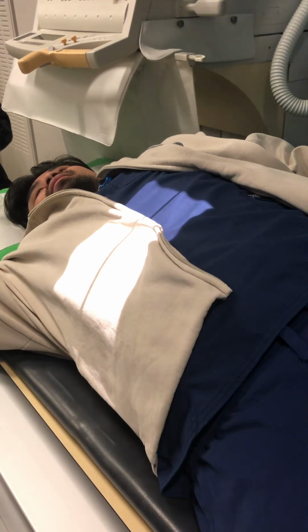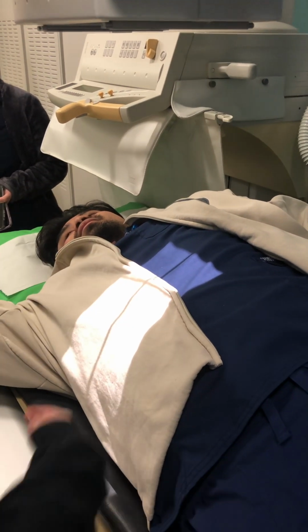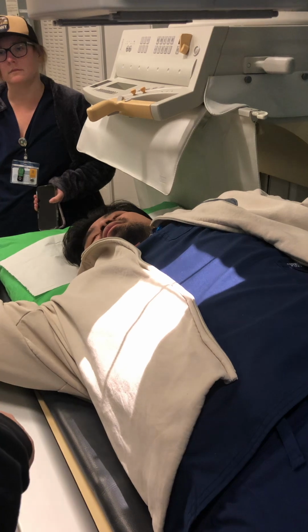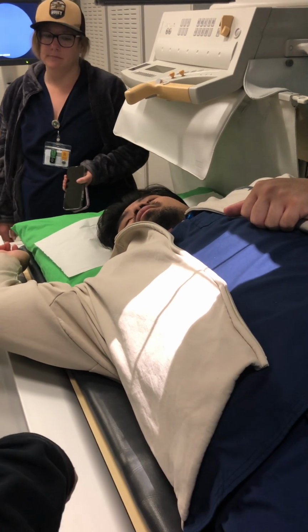So how do you find the centering horizontally on this one? So again, if you're going to think about going from here to here, I have more than enough space if I center back there. So I pulled it this way. But anything that will elongate. What's more important is to make sure you have the proper rotation. If you don't have enough rotation, it's not going to work. So again, I put an R down here. And then we would do the other side.